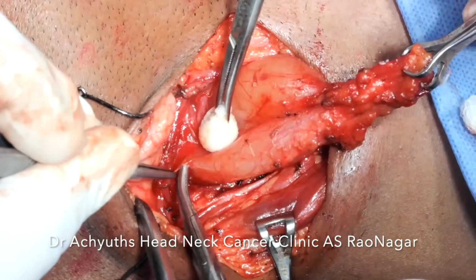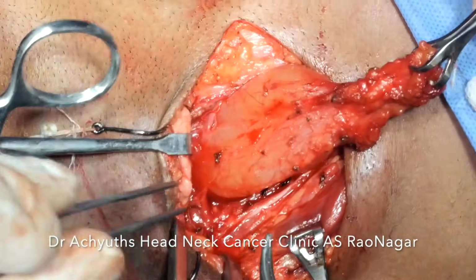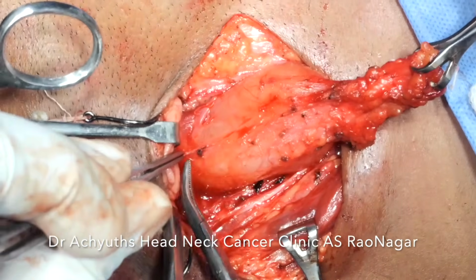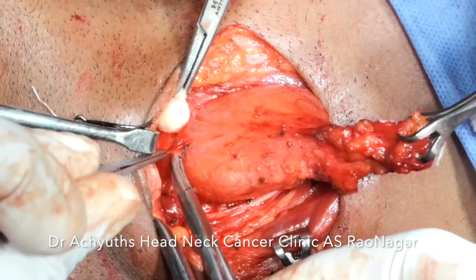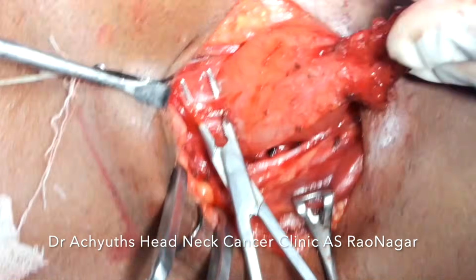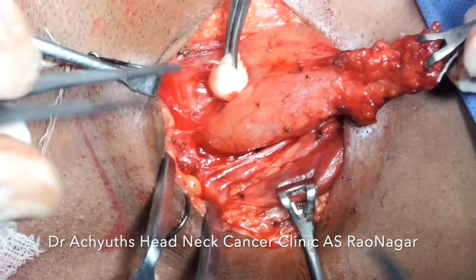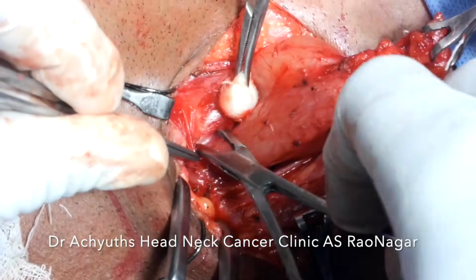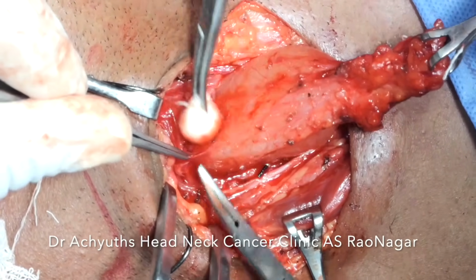People may not find it exciting because more or less all the steps look similar. It is only that we are using mosquito, dividing the fascia, then delivering the cyst. But the laryngocele excision is all about doing this only. There is nothing more exciting in this.